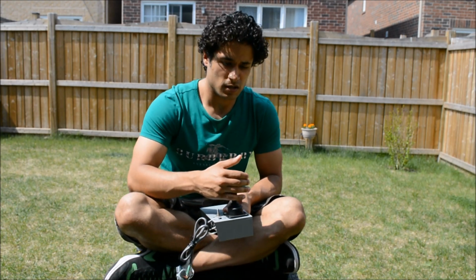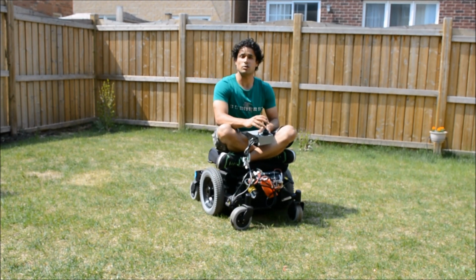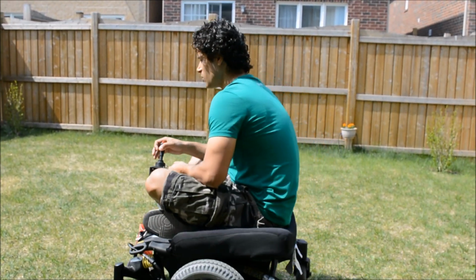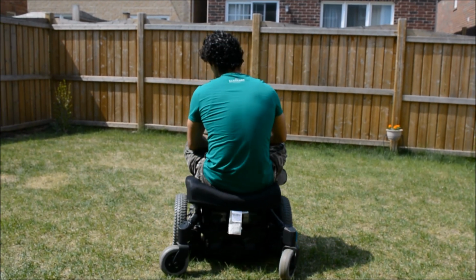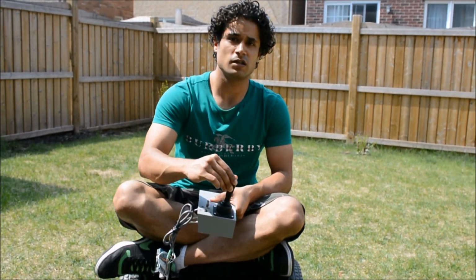So if I go reverse, I'll be going reverse. If I go forward, I can go forward without the whiplash motions again. If I go right, then it will go right. And if I want to go left, I'll go left. And also there's forward right and forward left buttons. And I can go reverse.